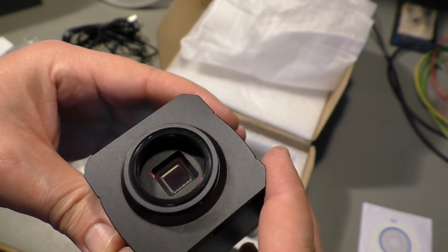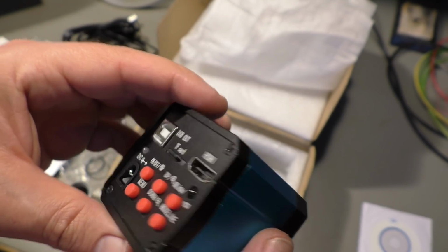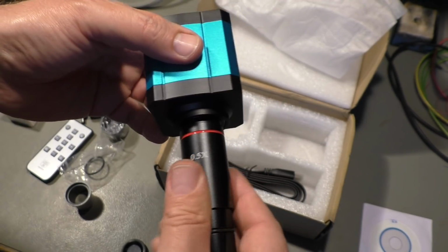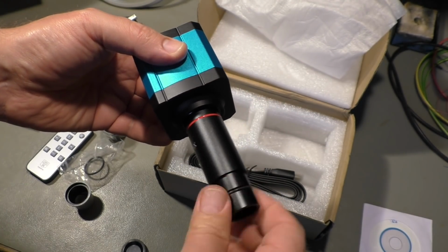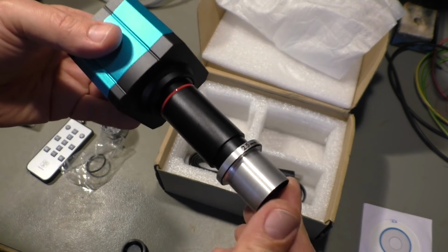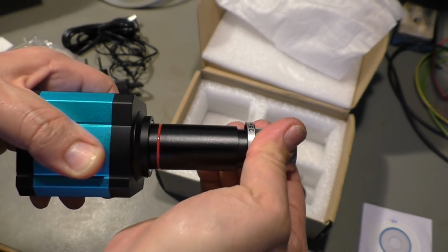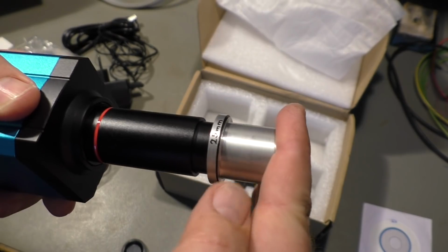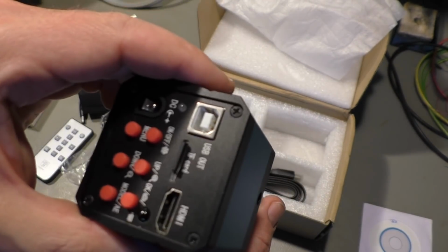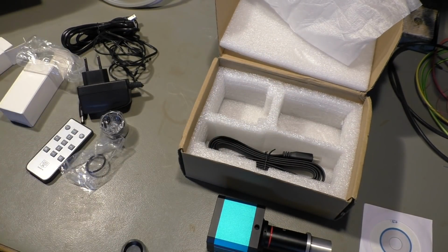Maybe we have the time to look inside. Shouldn't be too complicated. You know what? Okay, and of course that's the lens. Goes in like this. And we slide the adapter over that. There is a rubber O-ring here that holds everything together. And that goes into my microscope. But hey, don't turn it on, take it apart.